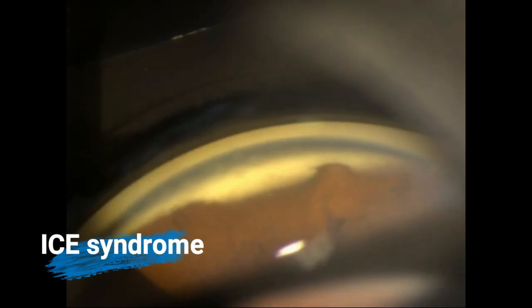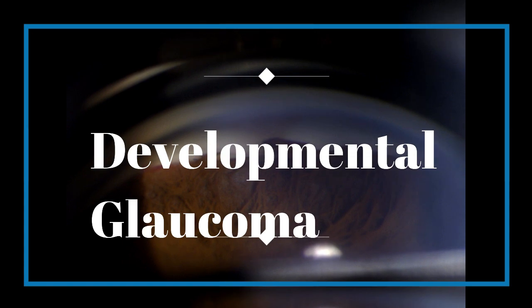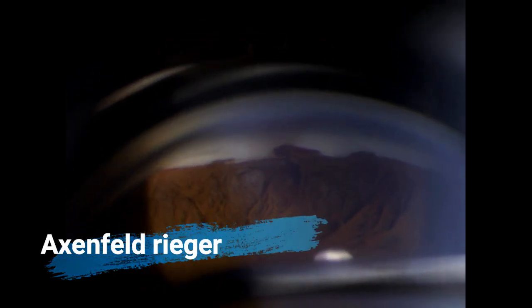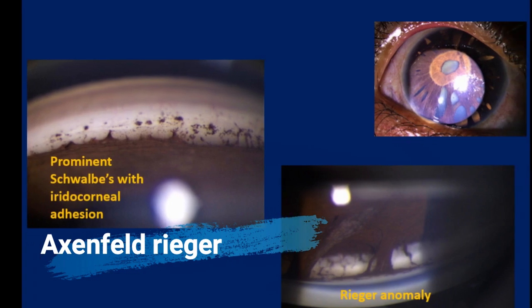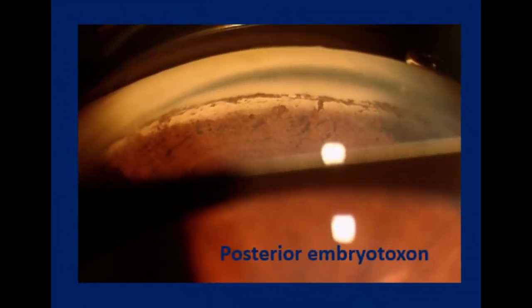In ICE syndrome, we see essential iris atrophy and iridocorneal adhesions. Cogan-Reese variant showing the nodular pigment and iridocorneal adhesions. In cases of developmental glaucoma, Axenfeld-Rieger syndrome, we see peripheral large iridocorneal adhesions, iris stromal thinning and holes. Here we are seeing the posterior embryotoxon, which is the anteriorly displaced Schwalbe line seen in cases of Axenfeld-Rieger.